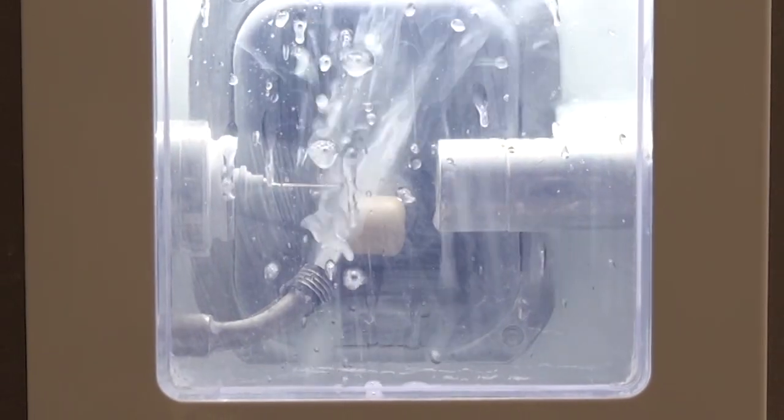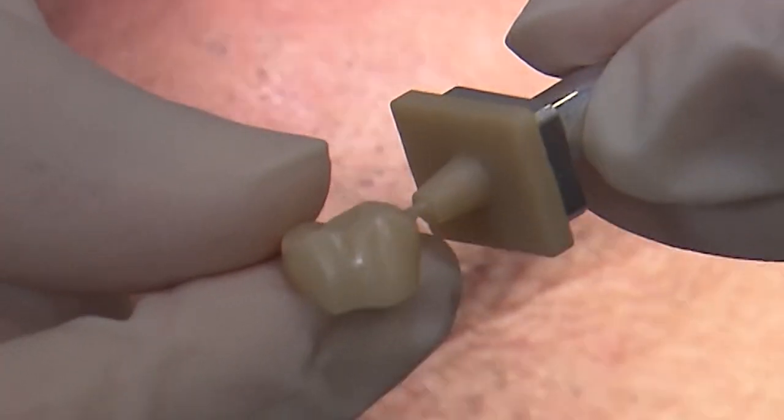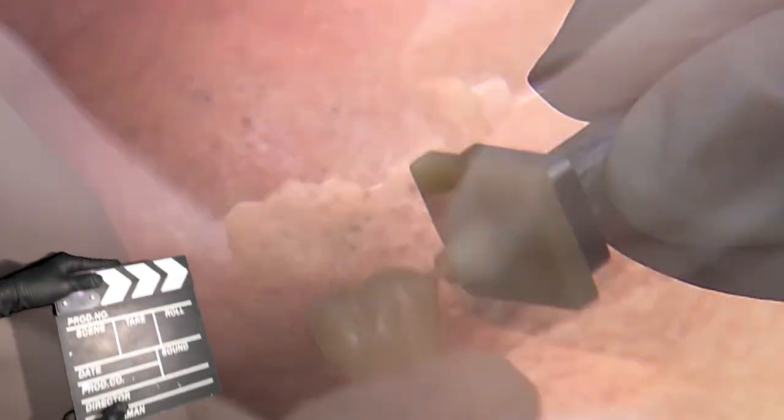When the design is complete, how does a 35-minute turnaround time for a fully sintered Bruxer crown sound?